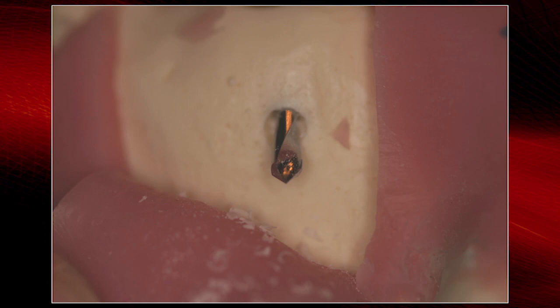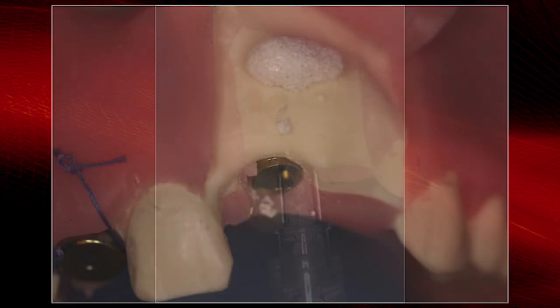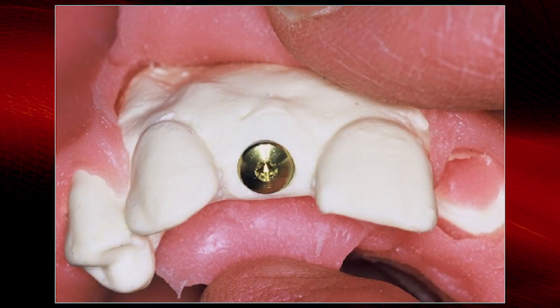So you can take bone material, whatever you like to use, and hydrate it with saline. Get it into a slurry mix, not compacted but very loose, and put it in the osteotomy. As you place the implant, it forces the material through the opening and seals it, because you have the periosteum and the tissue on the bone. So there again, you can see ideal placement, closer to the palatal bone and more bone to the facial.